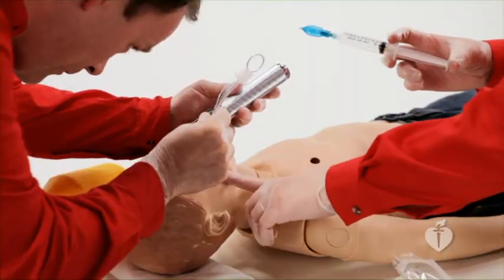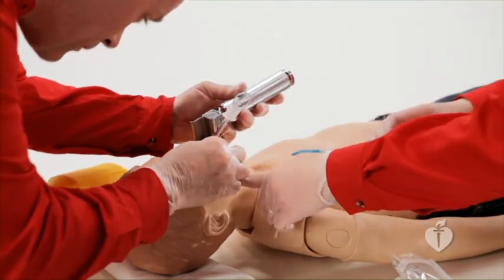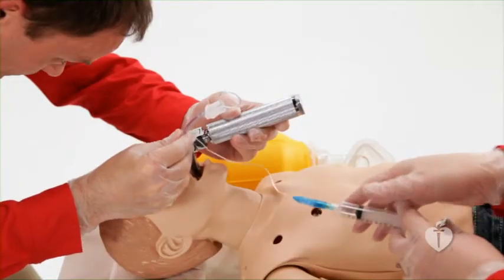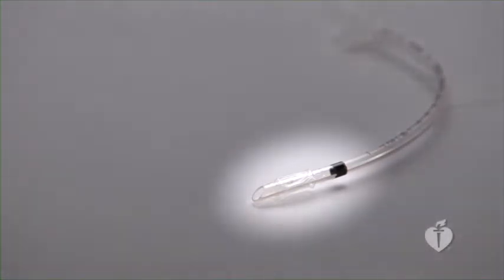An assistant may improve your view by applying tension to the right corner of the mouth. Insert the tracheal tube from the right corner of the mouth. Do not insert the tube down the central barrel of the laryngoscope blade because this will obstruct your view. Advance the tracheal tube through the glottic opening to the mid-trachea. Many tracheal tubes have a glottic marker that estimates correct depth when placed at the level of the vocal cords.